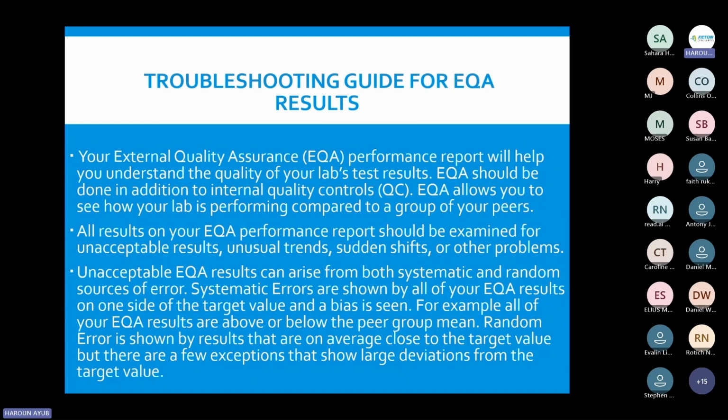Depending on the guidelines of your organization, some might be too strict and say we only accept a Z-score between 0 and 1.9999. So a 2 to 3 is not a failure, but a warning signal. Warning signals usually just indicate that you should check on this particular EQA before the next survey.